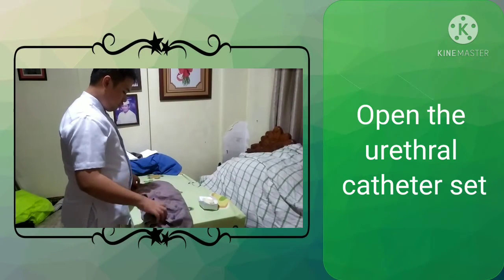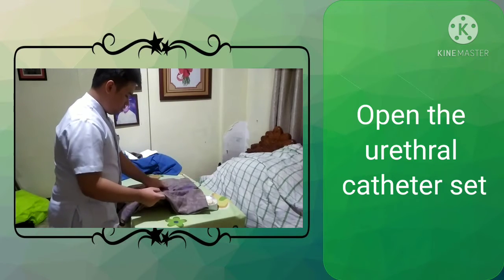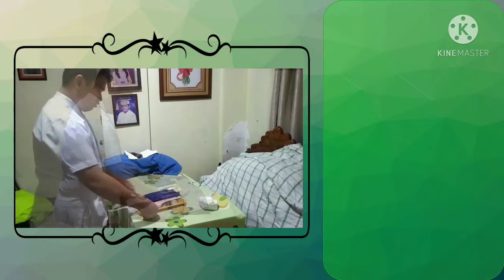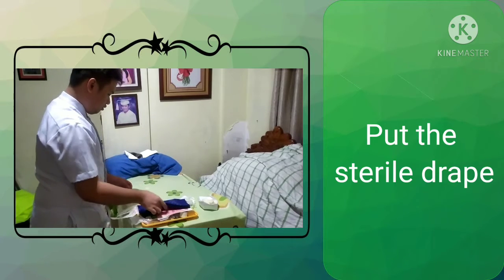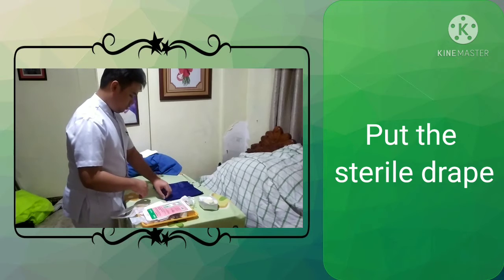Next is to open the catheter set. To set up the sterile field, put the sterile drape on the bedside of the patient.